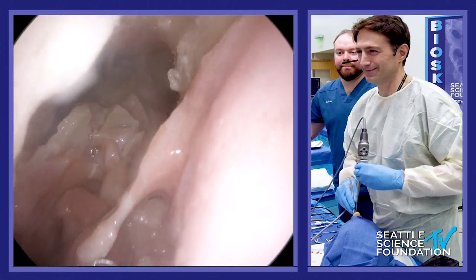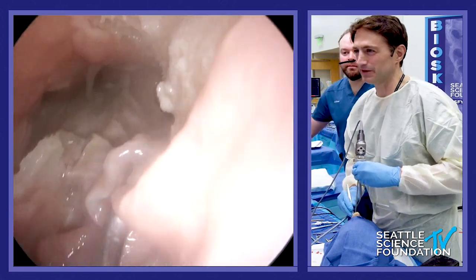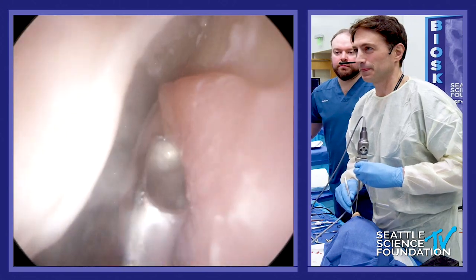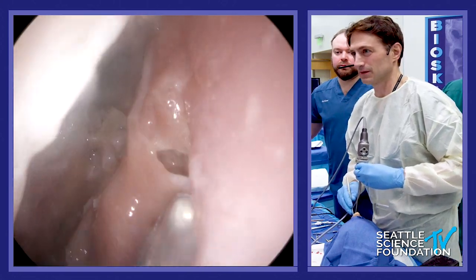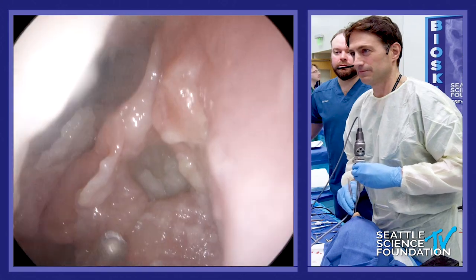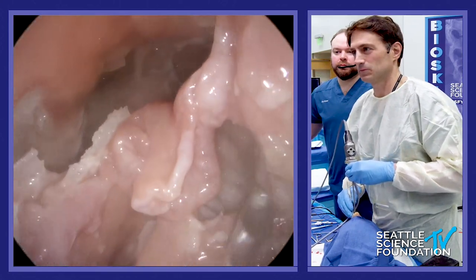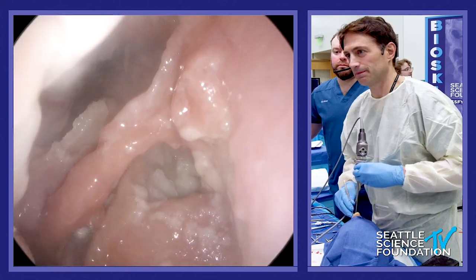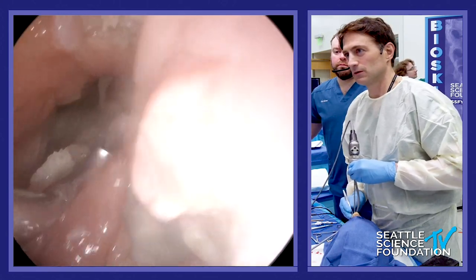Could be the cadaver too. Yeah, it thinned out a little bit right here — actually I think it's just twisted.